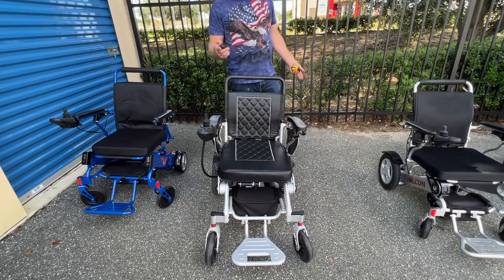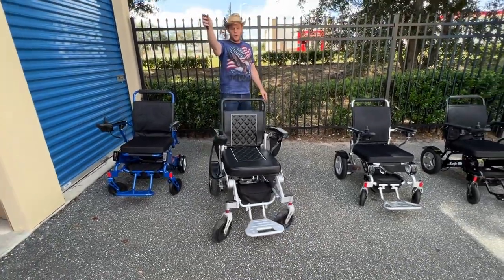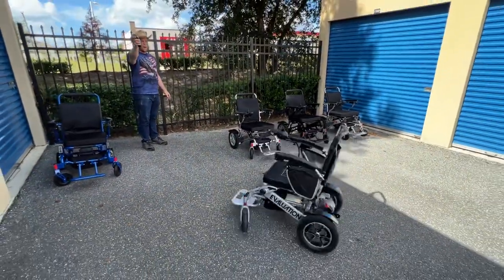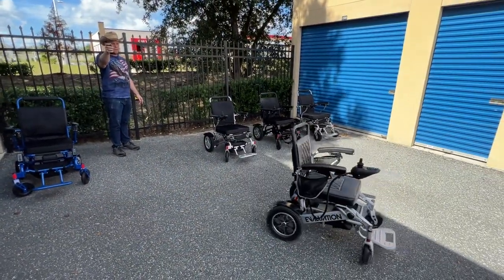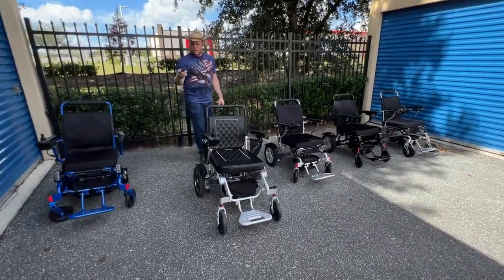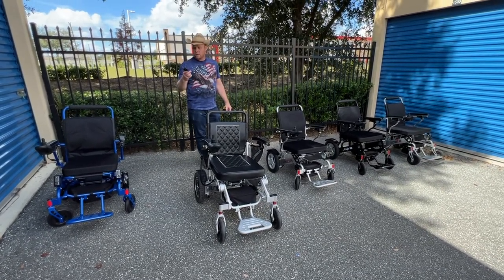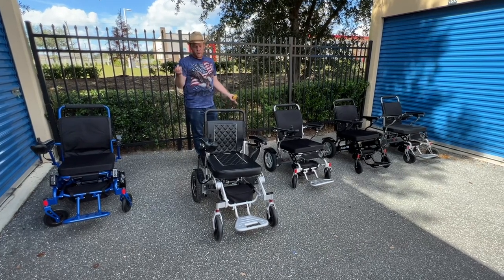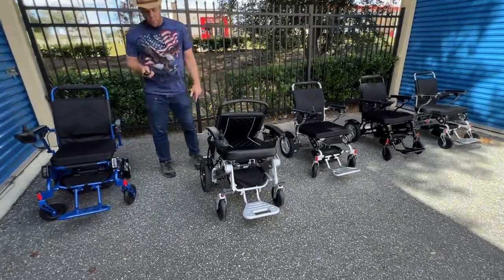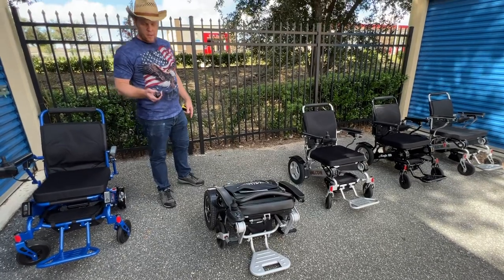With the remote control in hand, you can operate the chair up to 100 feet away — that's really neat for a lot of people and that's why they want this chair. You can even use the handheld remote to fold and unfold the chair. So we're going ahead and folding it.